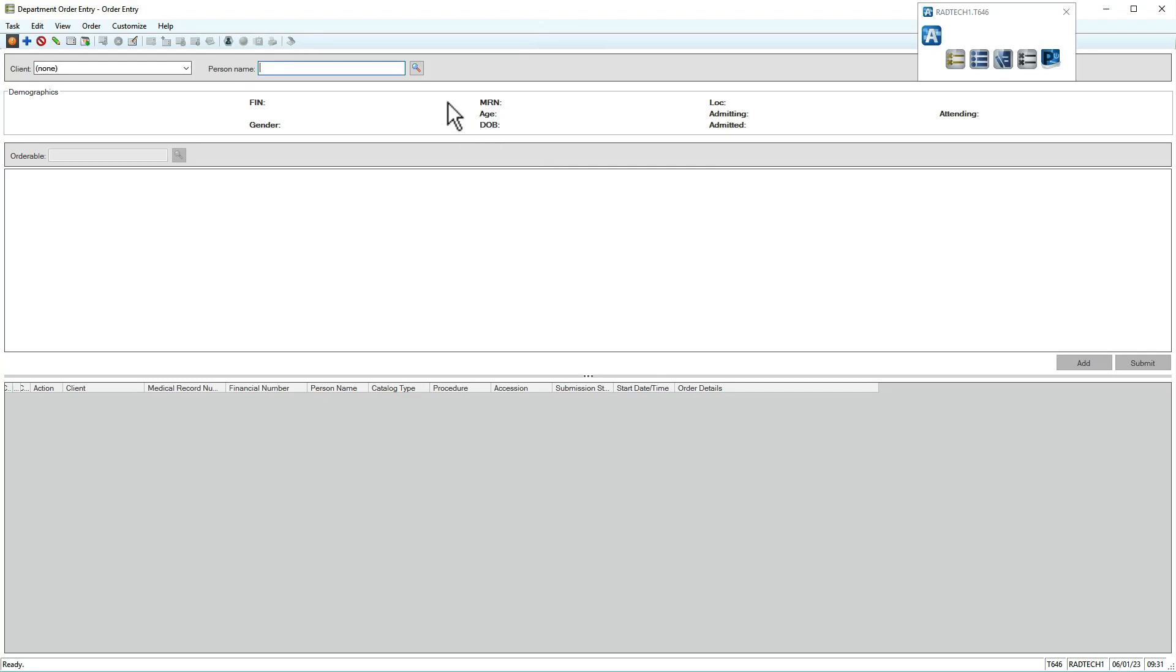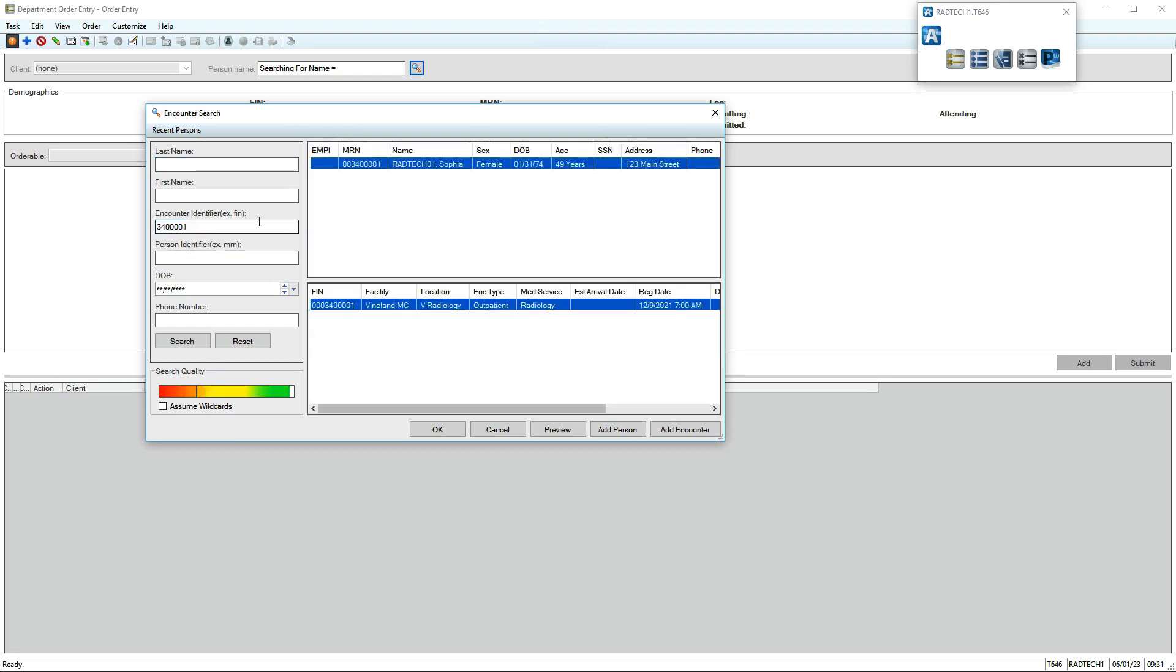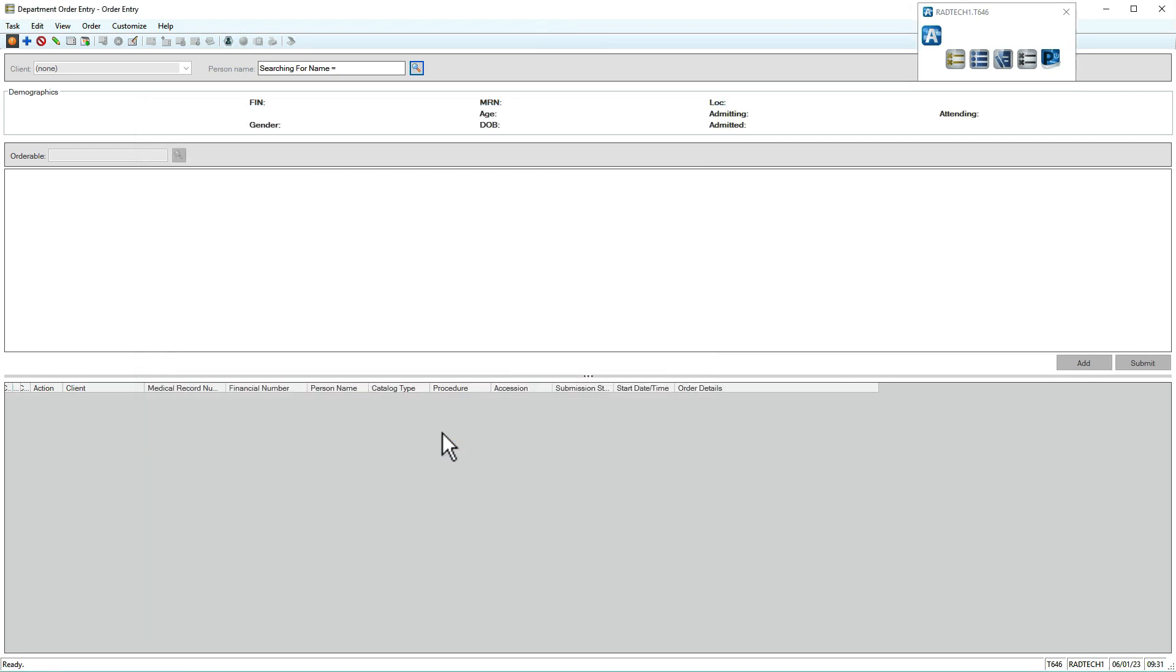First, search for a patient by entering details into the search field or clicking the magnifying glass. We'll search using the patient's FIN. Matching patients display on the top and their encounters display below. Ensure you're selecting the correct encounter, then click OK.